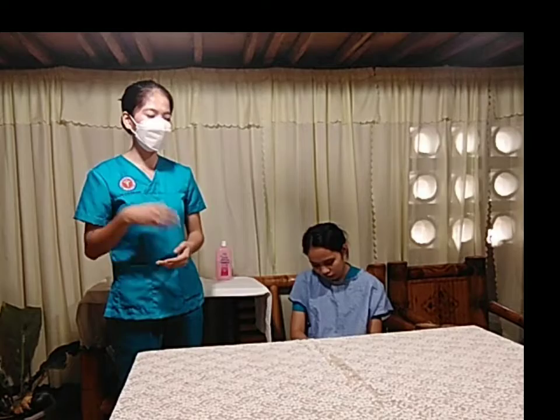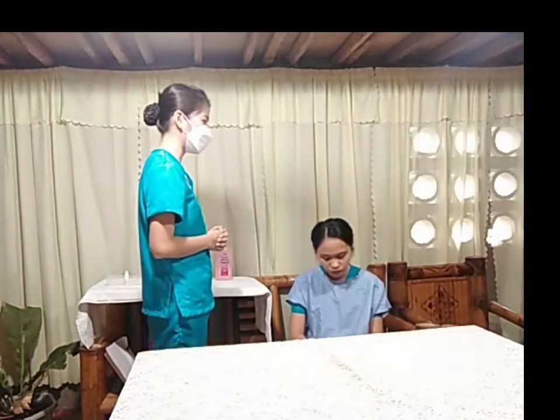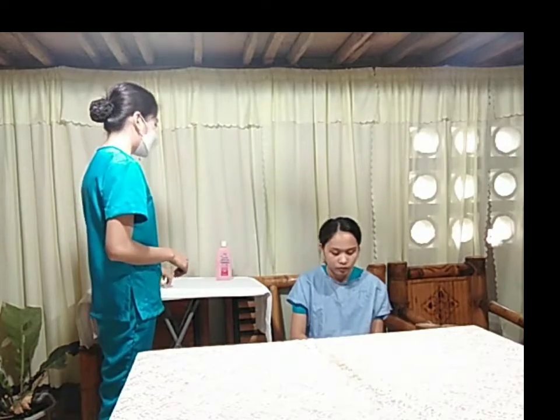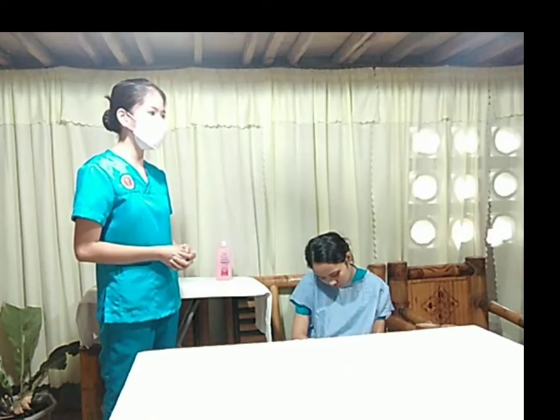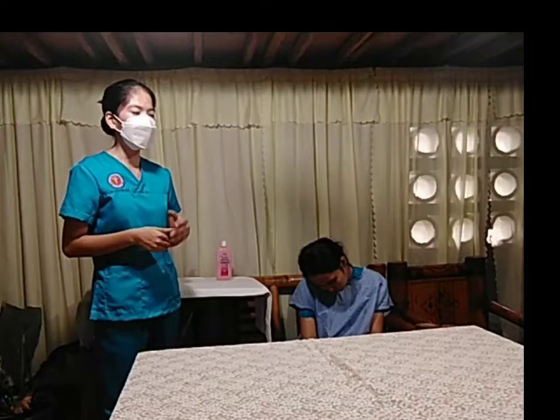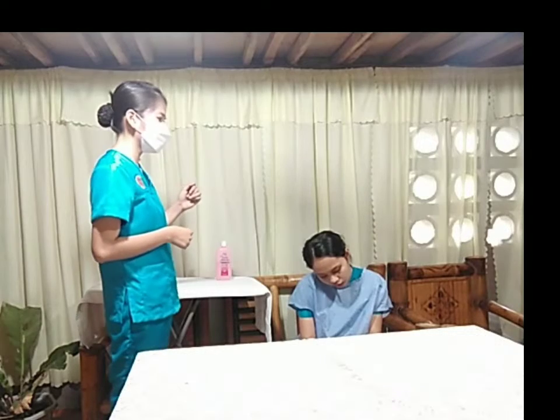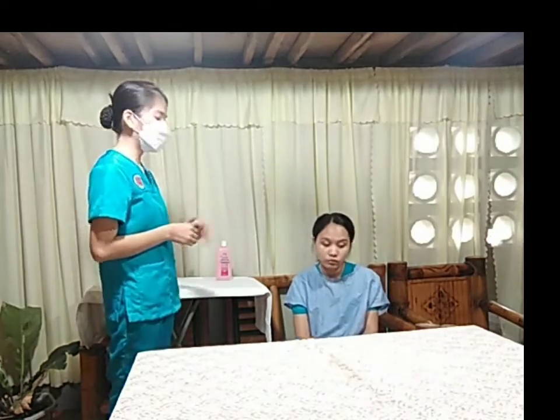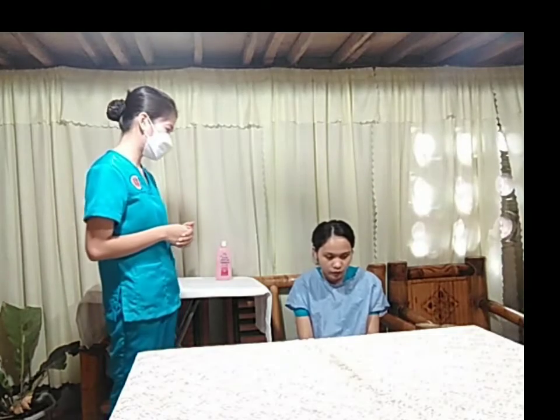The comparison between before naghatag medications and after the medication. So the result is nakaginhawa na siya tarong this time. Okay. And the next step is to ask the client to review the overuse of the medications. Okay. So we're going to ask the client to review the risk of overuse and the method of medication administration.